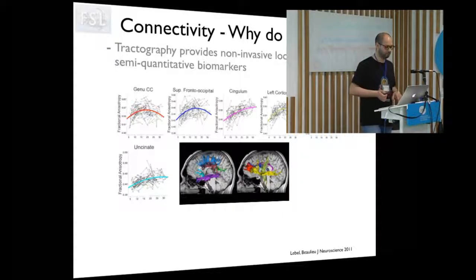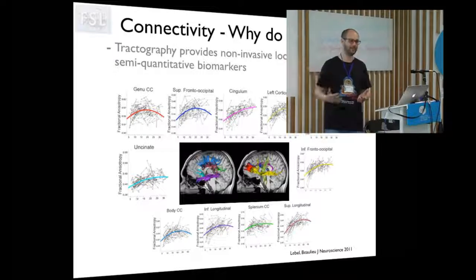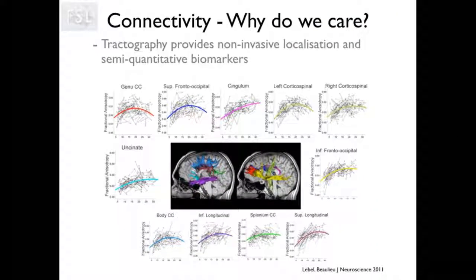You can do longitudinal studies or cross-sectional studies at the single white matter fascicle level, and combine the structural connectivity information with the microstructure information. So looking at the track-specific developmental microstructural profile and see how it changes, how it becomes different from track to track inside the brain and how it changes across the human lifespan.